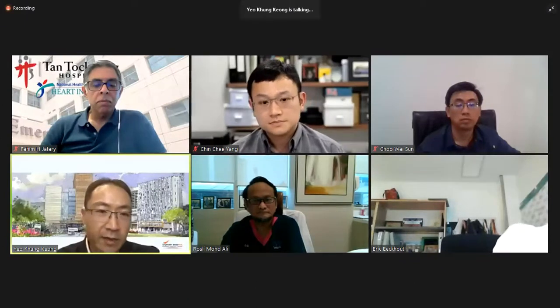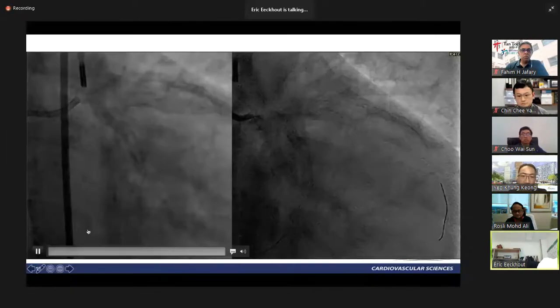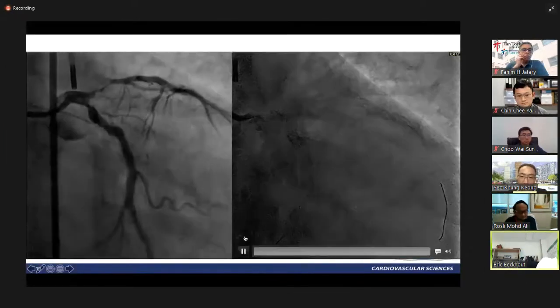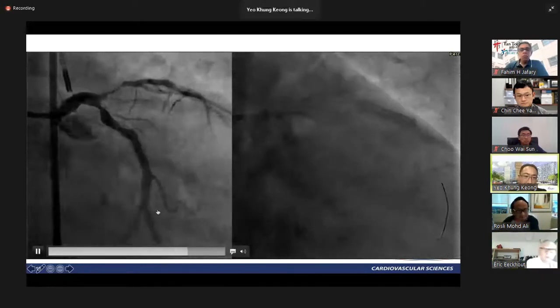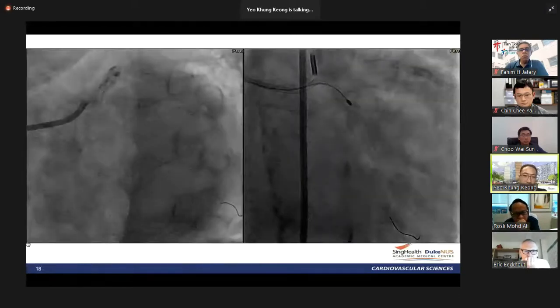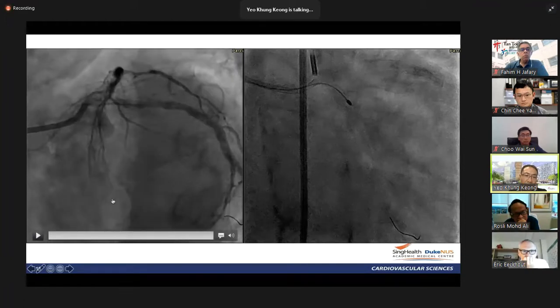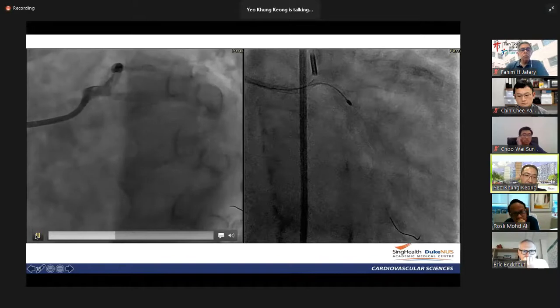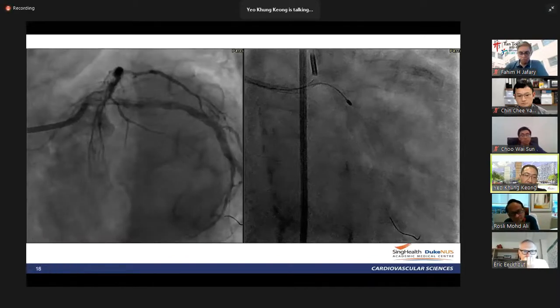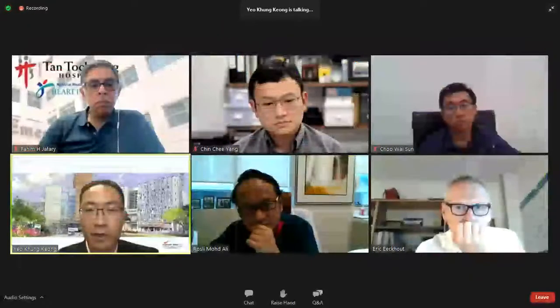So I think this is the slide. If you give me one moment, I will just flash it again. Can y'all see? Yeah. I think this view doesn't show it as well. There was one other view which I think would show that it was just hazy, and there was a lot of concern that I would lose access to this. The spider view showed the haziness a lot. So I think that was the main worry that we had when we decided to go with that.